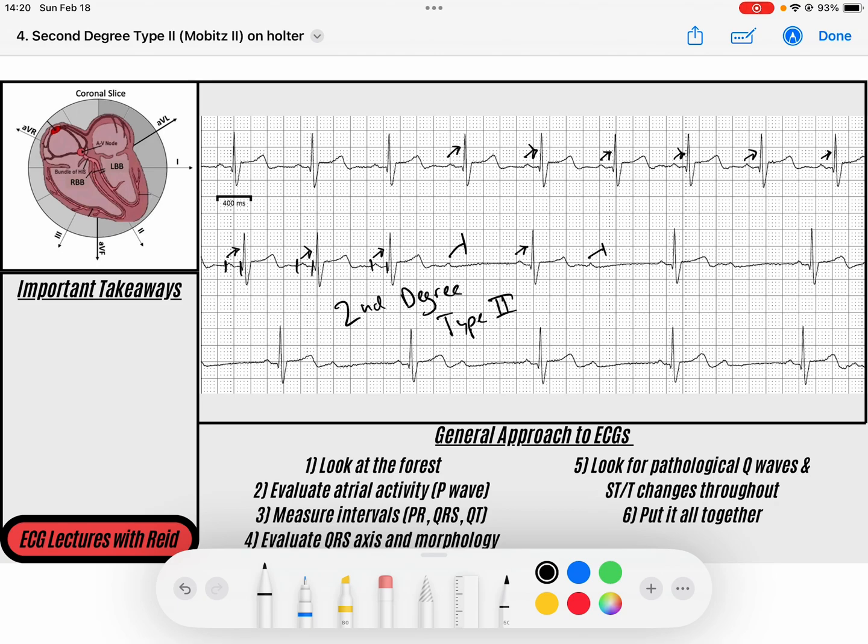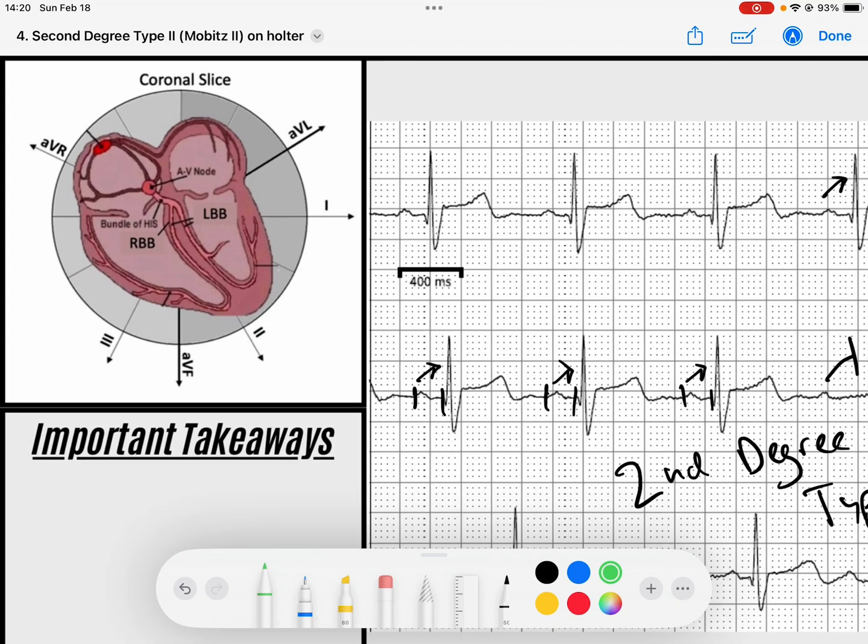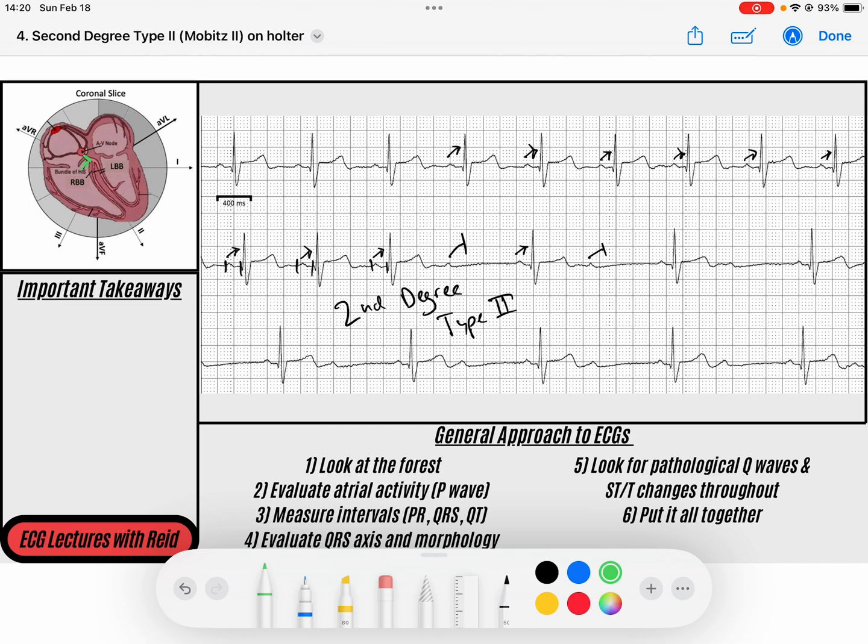Remember, this is because the site within the AV junction that is getting hit or diseased is that His bundle. Normally, you can see here we have a P wave that conducts to the QRS and a P wave that's blocked, a P wave that's conducted to the QRS and then a P wave that's blocked. You can see that this is what we would call 2 to 1 AV conduction. When it's 2 to 1, we don't get - in order to say that this is a type 1 or a type 2, we need to have consecutive P-QRS complexes. And we get that here. We see that behavior before the drop happens, so we know this is a second degree type 2.